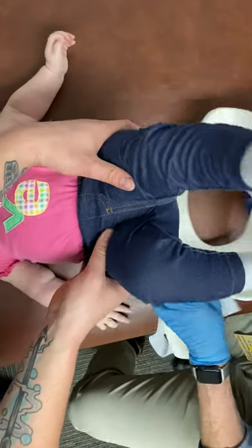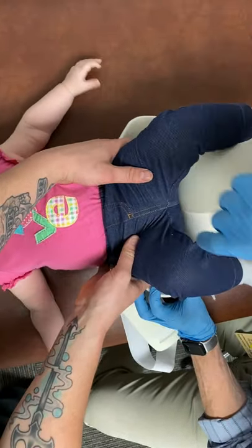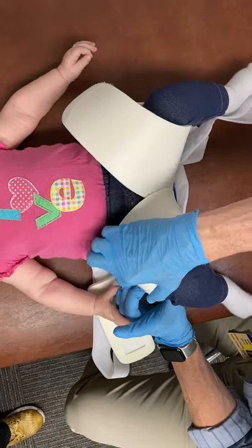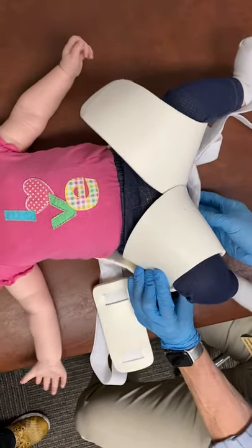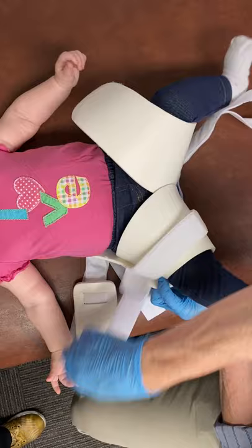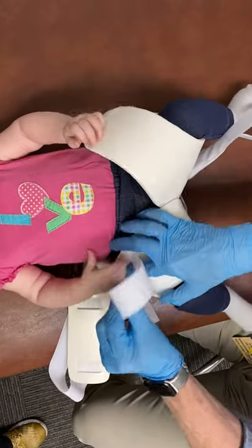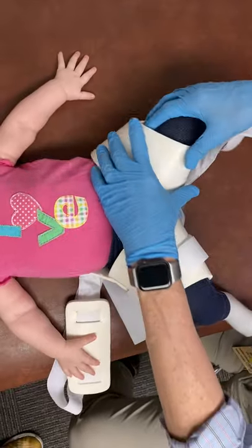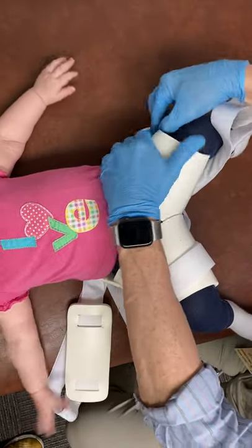Bring the legs up and drop the pelvis right down in there — you can see it just goes right down in that little hole. Then take this tapered edge and tuck it inside. Take this strap here and come into the buckle in this position. There are three straps and three buckles. I'm not putting it on real tight, just enough to hold those legs from coming back together — basically holding those legs out.